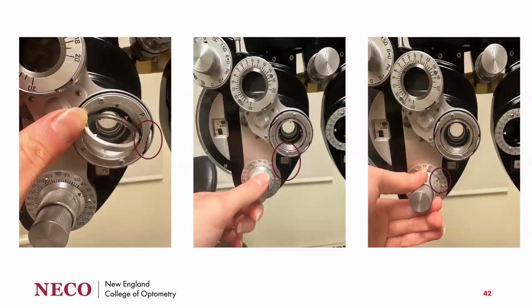You can see here that you'll use your thumb to rotate the dial to show them option 1 or 2. You can see that the cylinder power is added in that small box. We have 0.75 diopters of cylinder in there now, and turning the cylinder power dial on the outside. And to change your axis, you rotate the innermost dial. Right now we're at about axis 30. If the patient preferred an option that was in the direction of a red dot, we would orient towards the red.